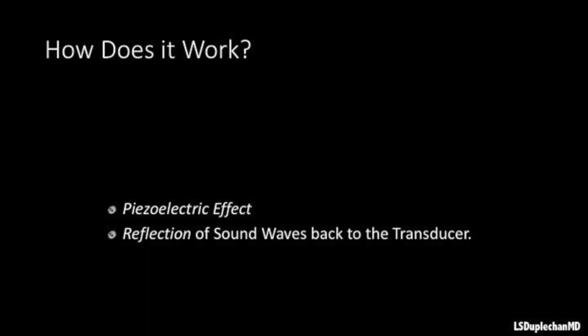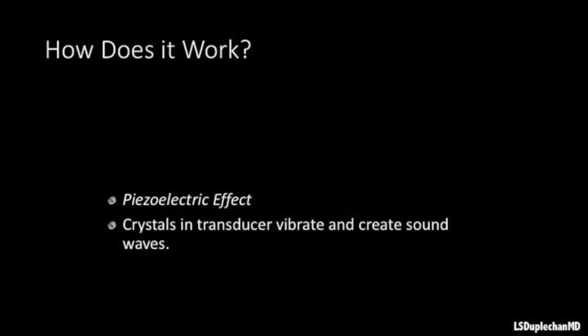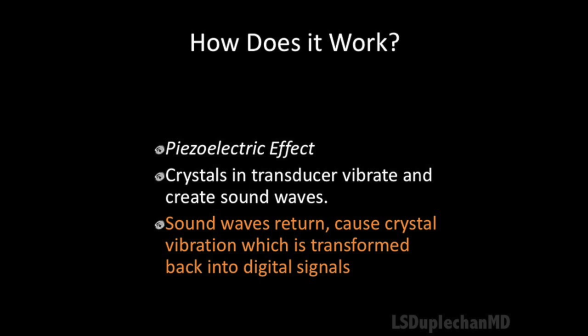We'll talk about 2 things. One, the piezoelectric effect, and the second, the reflection of sound waves back to the transducer. The piezoelectric effect stimulates crystals in the transducer with an electrical current, which vibrate and then send sound waves through the conducting gel and into the tissues. These sound waves are then reflected back from the tissues to the transducer, and the reverse of the piezoelectric effect transforms these sound waves into digital pictures.